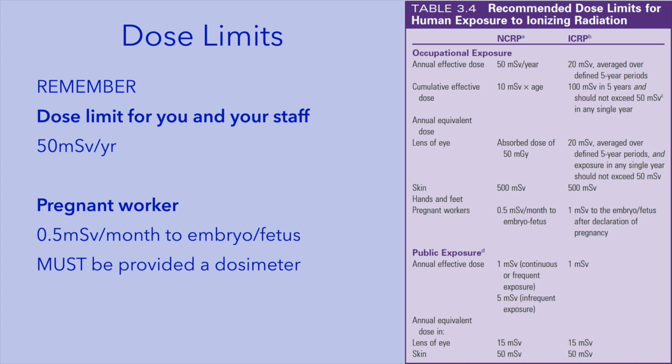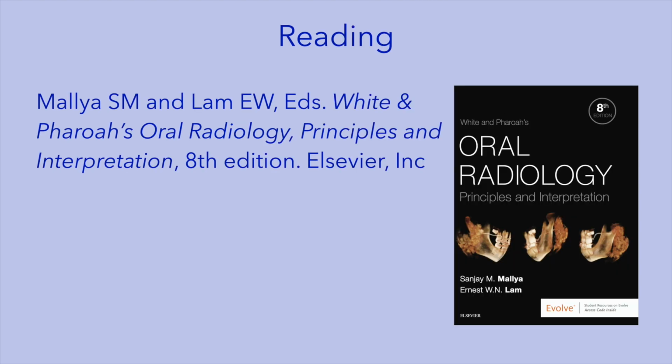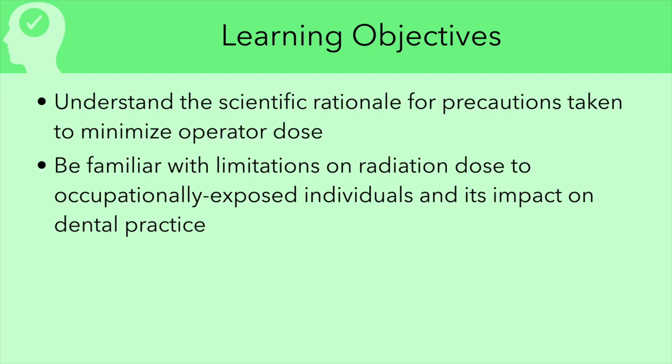Indeed, studies have demonstrated that occupational exposure of dentists and their staff is well below 1 millisievert, and thus typically dental offices do not use personal dose monitoring. With this information, you should now be able to safely use X-rays for diagnostic imaging.